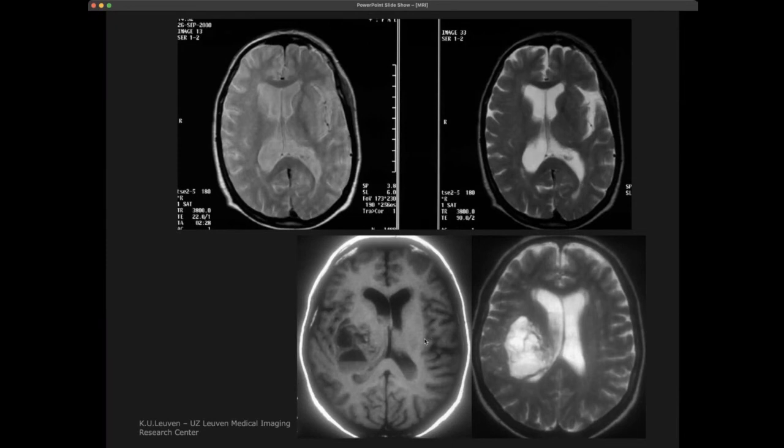Here is, for example, a pathological example where you see some cavities which are abnormal, and then you want to see, okay, is this filled with fluid, or is this maybe a fatty infiltration, or is this a hard infiltration? Is this, for example, fibrous or whatever? So by using the different pulse sequences, we can try to discriminate the different types of tissue and then see what we are actually dealing with.